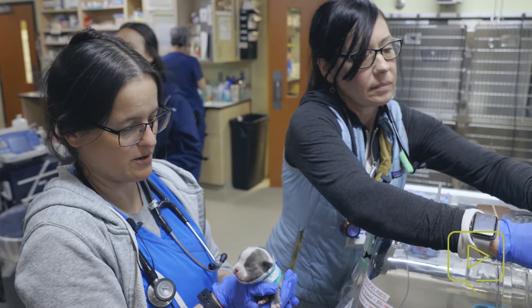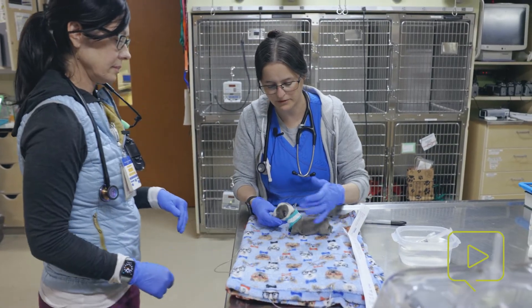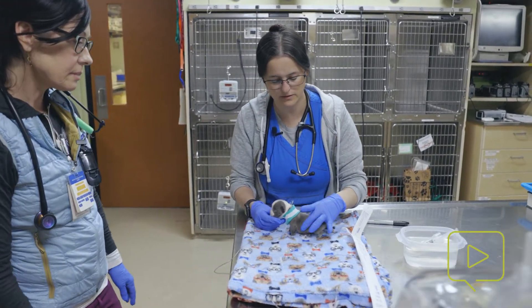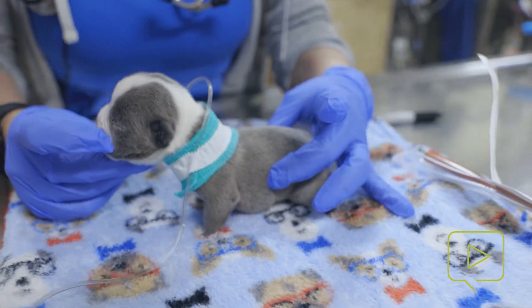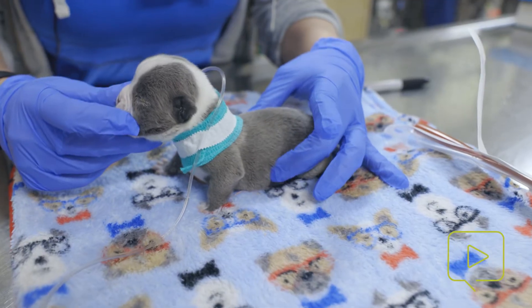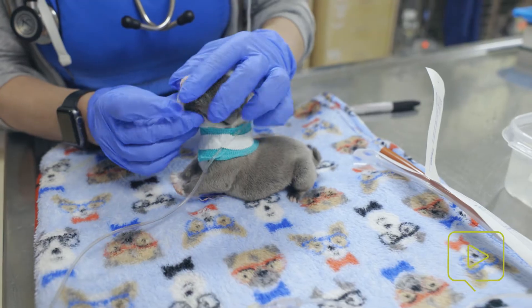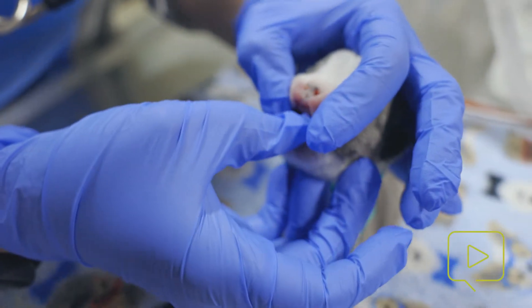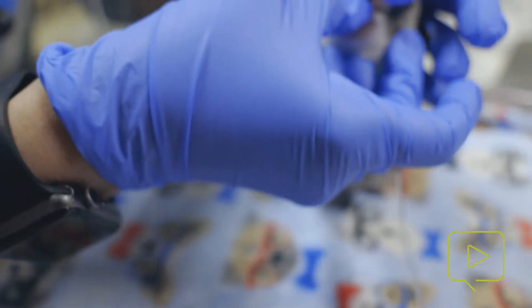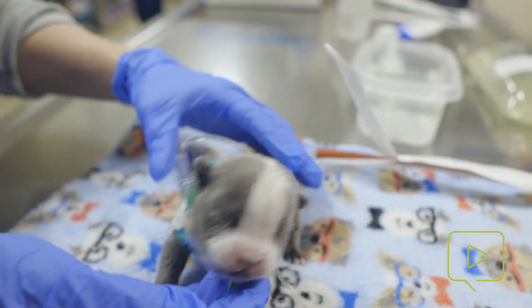You want to make sure your babies are warm before you feed them. Your measurement should be from the tip of the nose to the last rib. We're going to measure his tube from here to here, and you want it to be as straight as possible when you're taking that measurement — sometimes you can extend their necks if they'll tolerate it. This little friend does not have a cleft lip, but he has a cleft palate. It's a hard palate cleft — you can see that divot in the middle of his face.